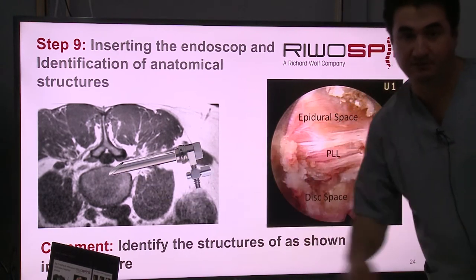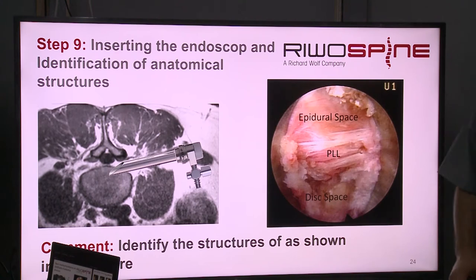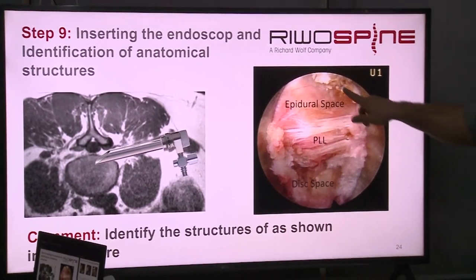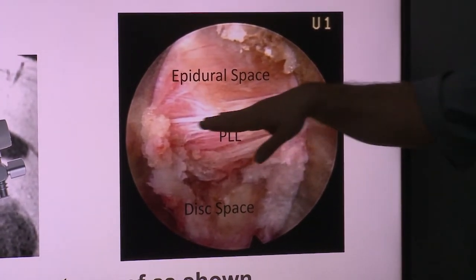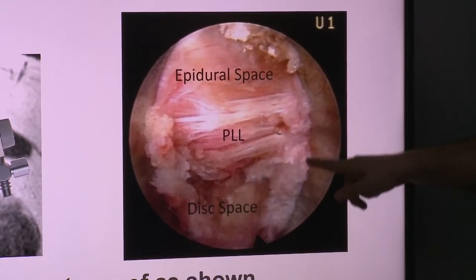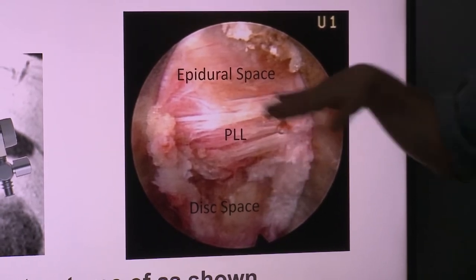You see, we are not inside the disc now. Okay. Maybe it's clear. And then we start with the endoscope. When you place the endoscope, the first picture is like this. Yeah? There will be the horizontal fibers here, epidural space, and the disc space. You see the tip of the sleeve is not inside the disc. This is lateral transforaminal approach.